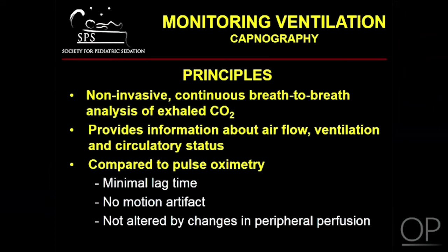Proper interpretation of this waveform can provide information on quality of airflow and ventilation, as well as information regarding the patient's circulatory status. This monitoring modality has several advantages when compared to pulse oximetry, including a lack of lag time and motion artifact. Additionally, capnography is not dependent on peripheral circulation, and thus is reliable even in situations of diminished peripheral perfusion. Note, however, that end-tidal CO2 values may be lower under conditions of poor pulmonary blood flow, seen in cardiopulmonary arrest and pulmonary embolus.